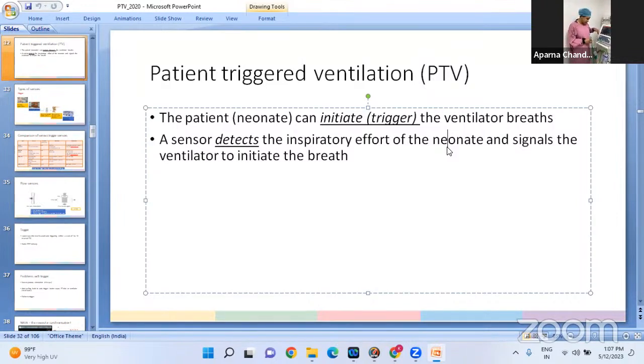But whatever the mechanism, only when there is a resistance would some pressure be delivered to the patient, because depending upon the resistance offered, gas would flow to the patient. So typically, for delivering PEEP, which is a lower number than PIP, the resistance offered will be partial. If the resistance offered is more complete, then more gas will be pushed towards the patient, which results in delivering PIP. Now, for how long the valve is partially occluded versus completely occluded is determined by us setting the E time and the I time.